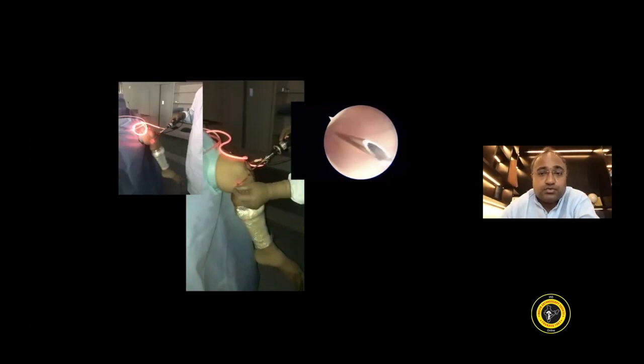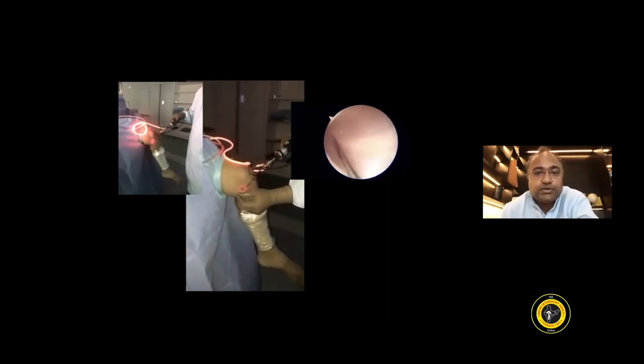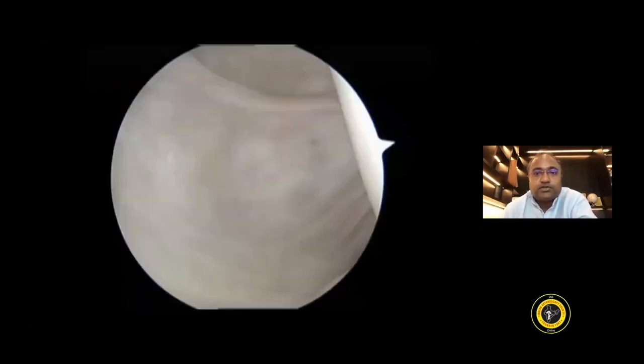Another trick is to turn off the OT lights, look for the transillumination, and make sure that your needle comes to the center of the transillumination. This again will help you visualize any nerve shadows that can help you, and you will be in a safe area. Now this is the short video of the technique that I use using the lasso-like devices.